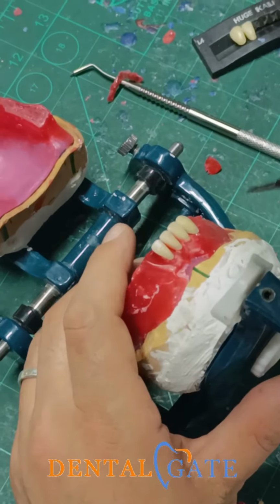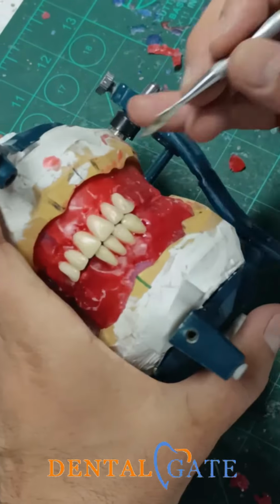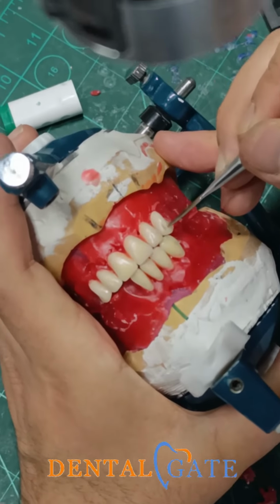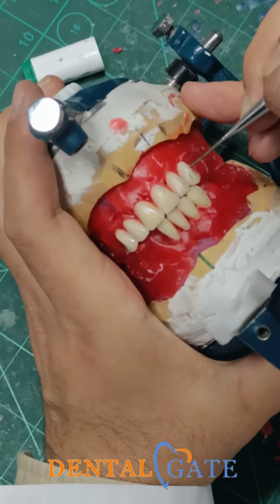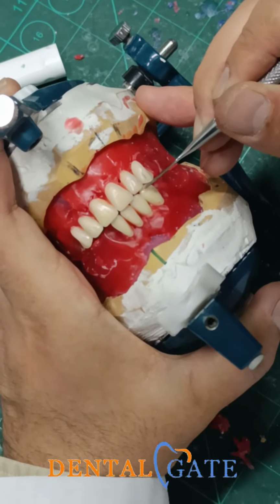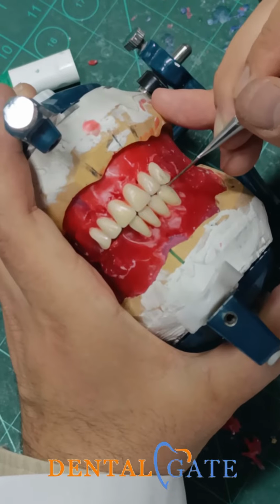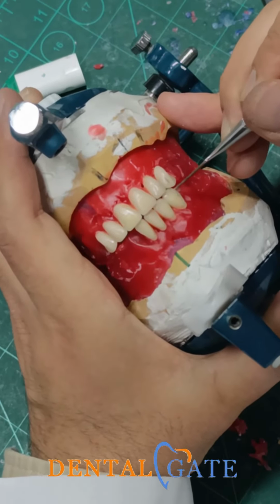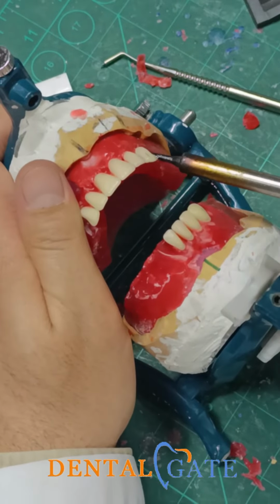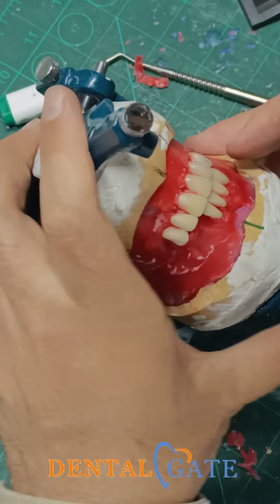If you have severe anatomical teeth, you can make an evaluation. The labial ridge should be included within this groove. Okay? You can see it will be anatomically inclined to the distal, and we have it anatomically inclined to the medial. So this ridge should be included within this groove, between the mamelons. But sometimes we don't have anatomical teeth. Just preserve the overjet and the overbite.